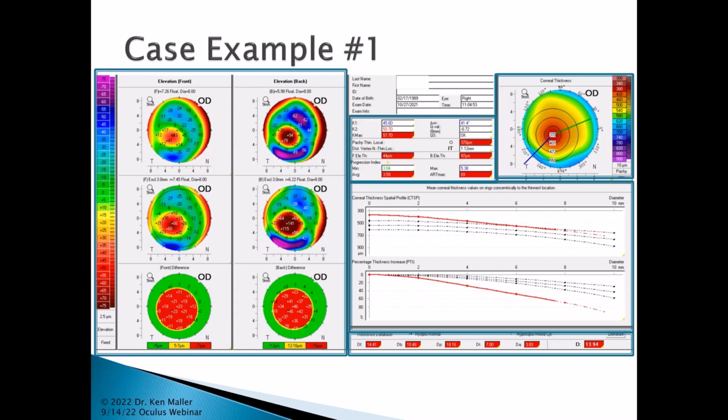And once again, if you're looking for just one quick number, do I have keratoconus or not, that's a good number to take a look at, but you still really do need to take a look at the clinical picture, because sometimes corneas will have some funny presentations. But that is a very, very good way where if you start seeing yellows or reds, that will draw your attention in to look a little bit further.